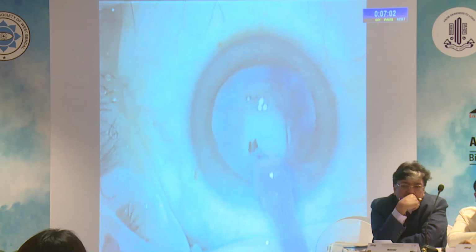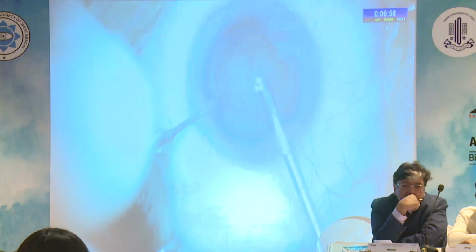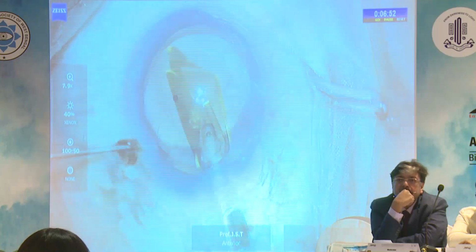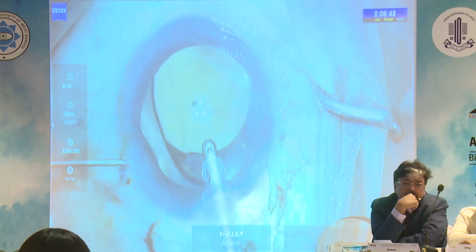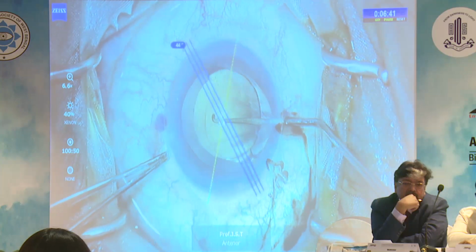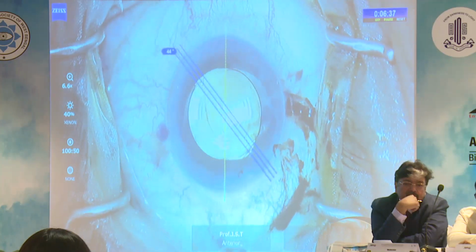Posterior capsular rupture is a dreaded intraoperative complication encountered during phacoemulsification surgery. It becomes even more problematic when it occurs in a case planned for a premium IOL implantation owing to high patient expectation. A ruptured posterior capsule, however, does not necessarily preclude the implantation of a premium IOL.